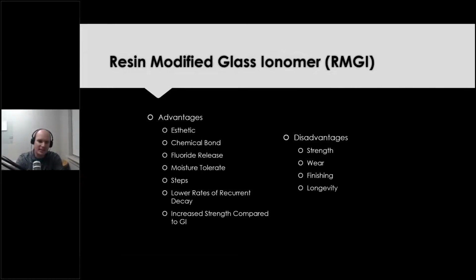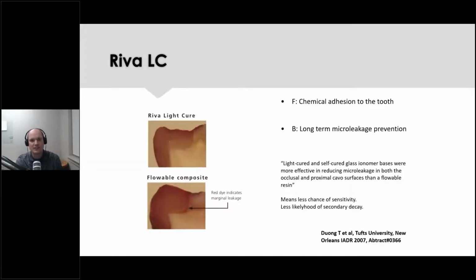One thing that I will say is that it still does wear quite a bit more than a composite does, but less than a glass ionomer. So that's the compromise that you might find. I use this for primary teeth class 2s, and I had very good success with it, and we've been very happy with it. I've also used it in quite a few permanent teeth in select situations, and it's worked out well too. I'll share some cases here.